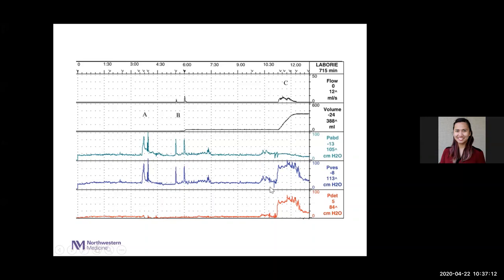And then we get to here, and the patient is probably given permission to void about here. And the patient tries to go a little bit, which, like I said, is typical. You're not going to see this great, beautiful curve every time someone pees because it's difficult for patients to pee on a stage. But this could be or could not be a normal voiding pressure. The flow here is about 12, which means here it's about 15.